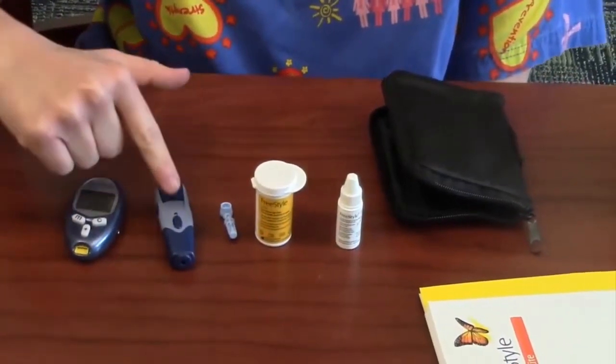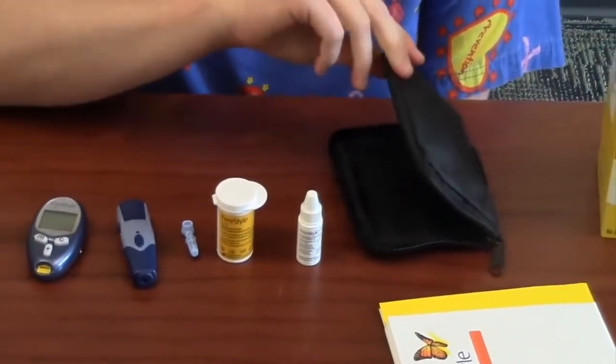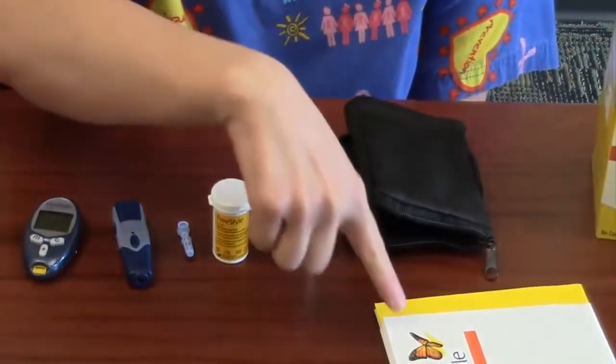Inside the box for the Freestyle Light, there's the glucometer, the lancing device, lancets, test strips, a control solution, a carrying case to put everything in, and a Quick Start Guide.